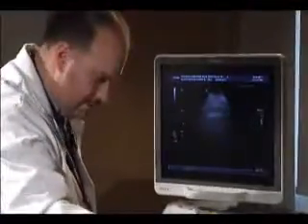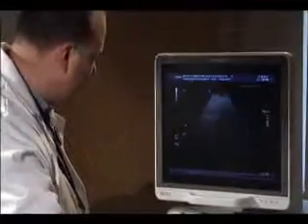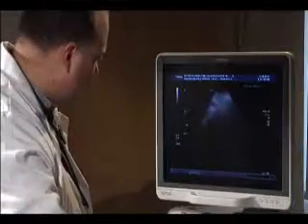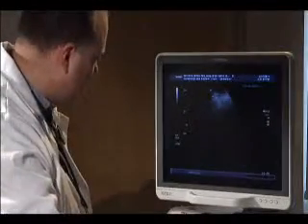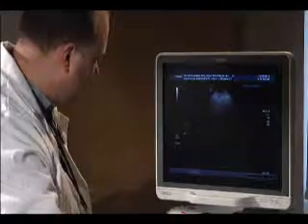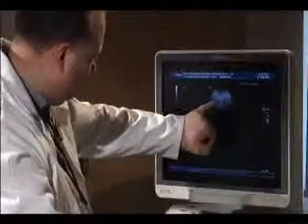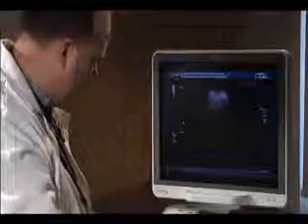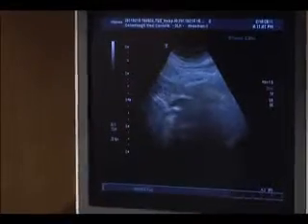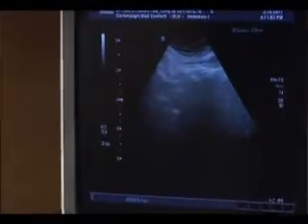And what we do — I don't know how much of this you can see — but we simply scan up and down through the abdomen following the abdominal aorta, and we're going to measure it from its largest section.